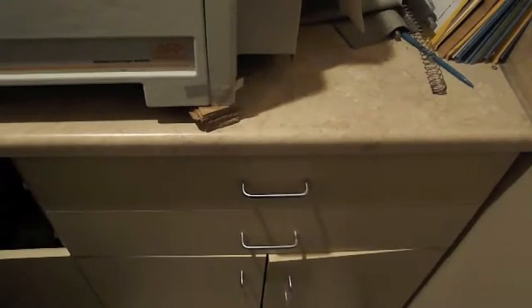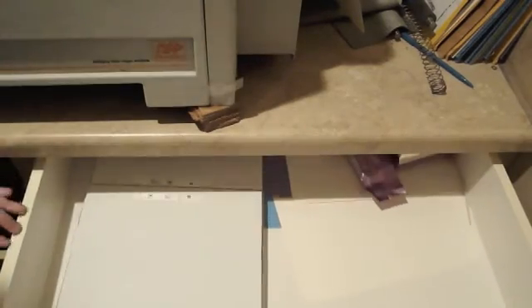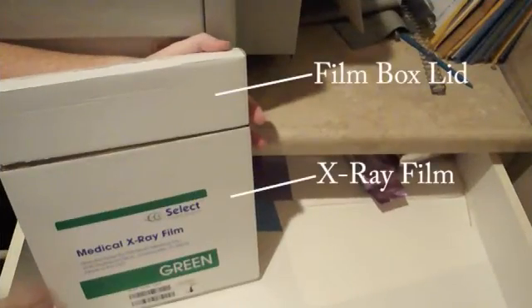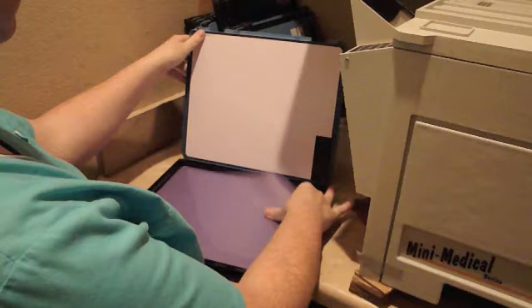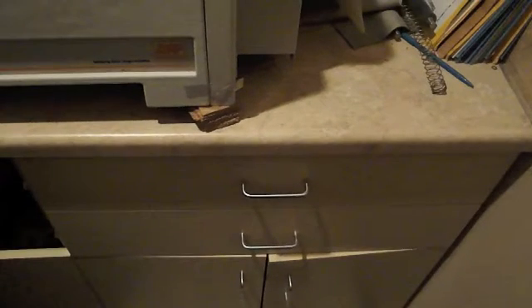After you've placed a film in the developer, you will need to refill the cassette with a new unexposed film. The box of film is found in the drawer at waist level on the right side of the machine. Open the box lid and unfold the black wrapping over the film. Grab one of the films and place it in the cassette, making sure you have it oriented in the proper direction. Once you have done this, and you have loaded all used cassettes with unused film, fold the black protecting wrapping over the film again. Firmly place the lid back on the box. Make sure there is no unexposed film when the door is opened. Make sure the box is sealed with the lid and the drawer is shut tightly before opening the door.